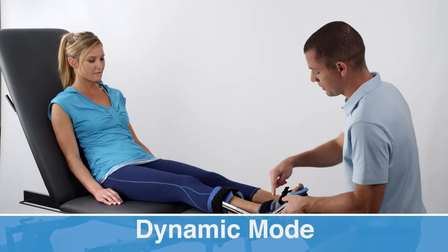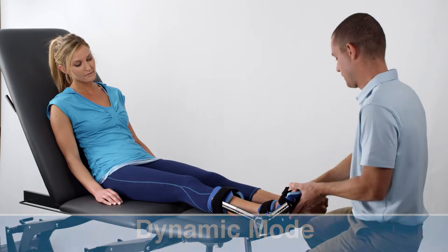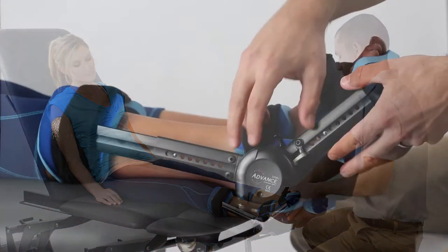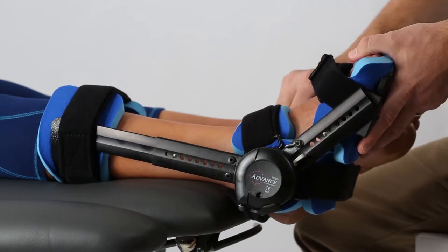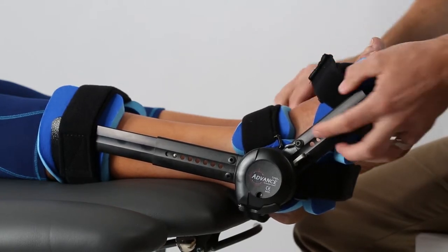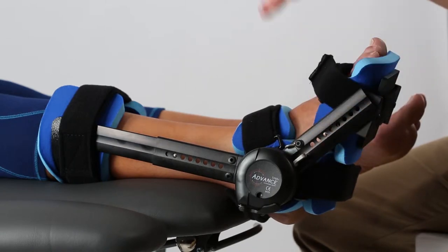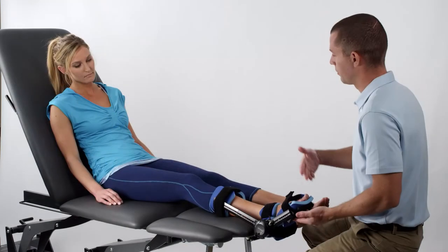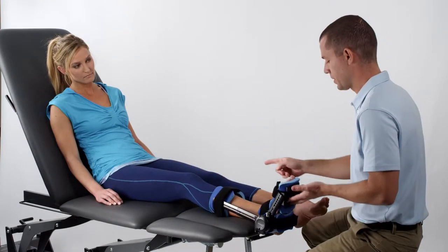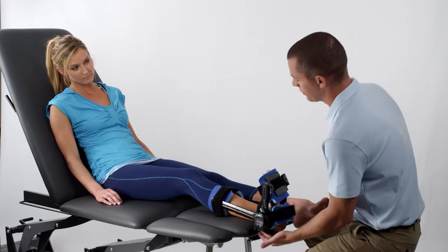With the device secure and properly adjusted, the next step is to place the device into dynamic mode. First, disengage the lock lever's safety by swinging it away from the lock lever. Then apply a slight force on the strut to disengage the lock lever. The ankle orthosis now provides a dynamic stress on the ankle.